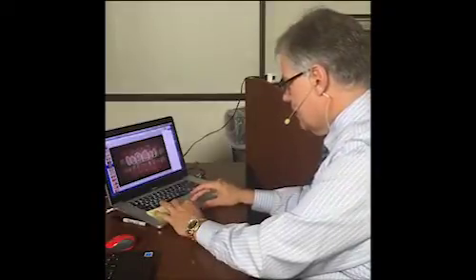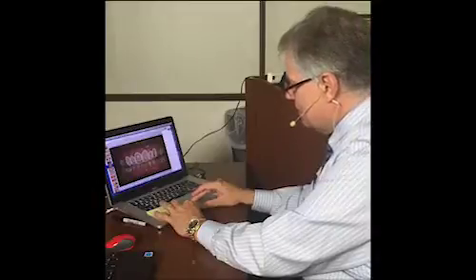So I usually kind of center and put this where I think I would like to have incisal edges. So I'm going to go about there. Is that okay with everybody?